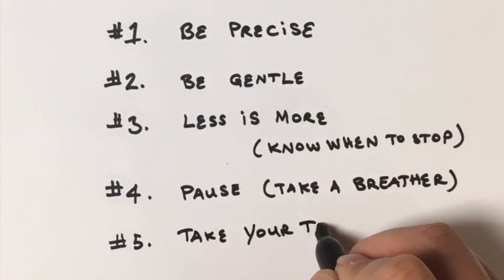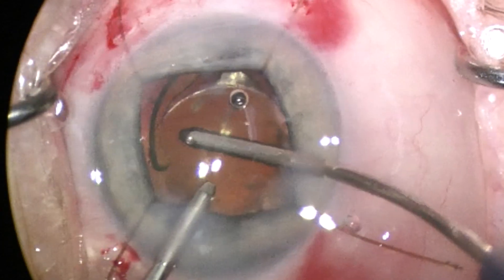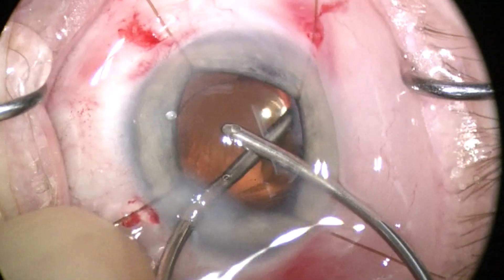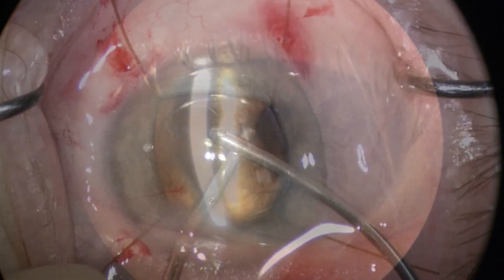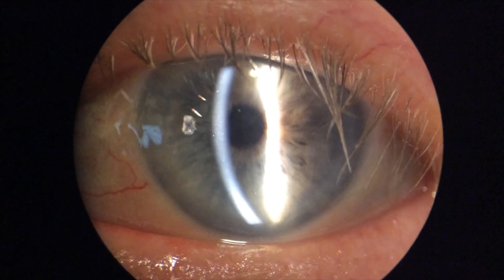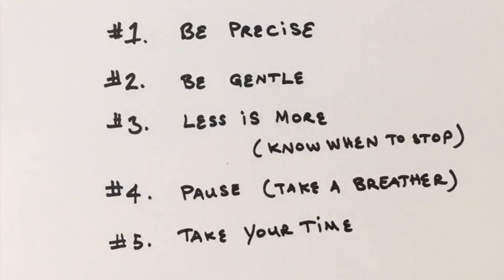Tip number five: Take your time. Use bimanual techniques with smaller incisions to avoid wound egress. Bimanual irrigation-aspiration allows approaching removal of cortex strangled around the IOL haptic from different angles without having to do unnecessary intraocular acrobatics. Routine post-op appointments in patients that had unexpected pupil constriction with floppy iris during surgery are the most memorable. With practice, these tips will help you conquer the floppy iris.